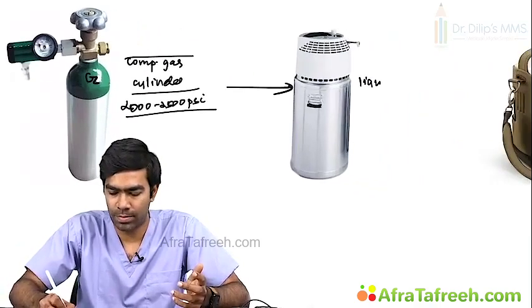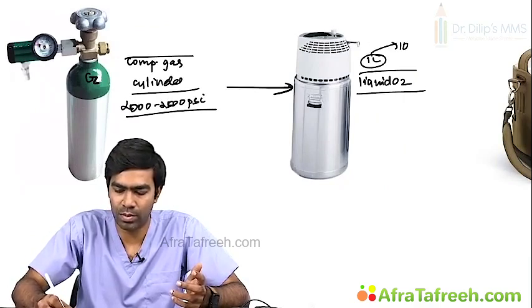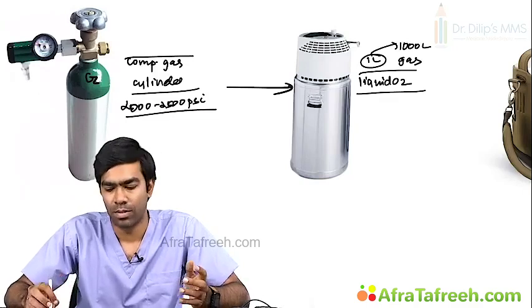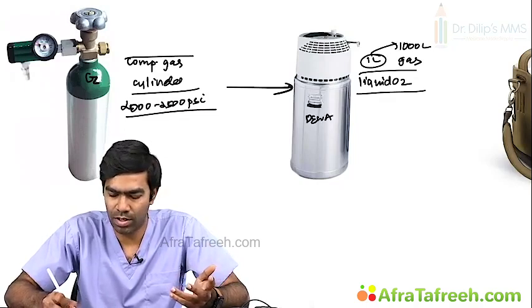liquid oxygen. The advantage of liquid oxygen is that 1 liter of liquid oxygen will expand to 1000 liters of gaseous oxygen. But you need not have any cryogenic temperatures either, because we use a simple principle called the Dewar flask. It's an 8th or 9th standard level topic, where when you give thermal insulation in the form of vacuum around a particular thing, if you don't expose it to heat, it doesn't boil or lose its temperature. So this is a simple upgradation of a Dewar flask. So use that and maintain the liquid oxygen.